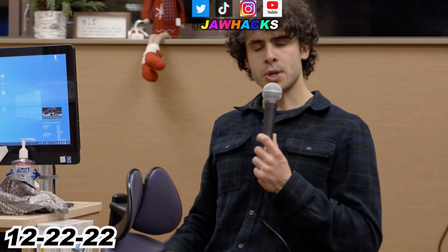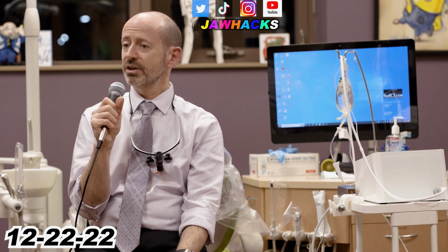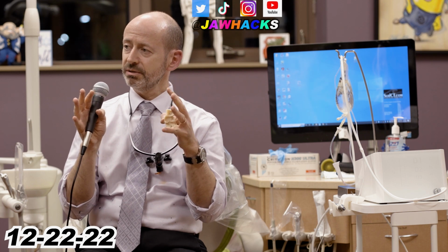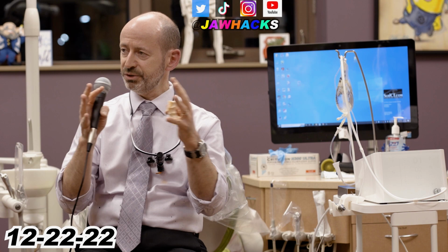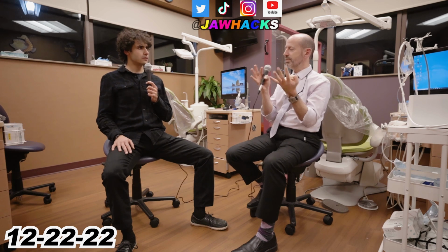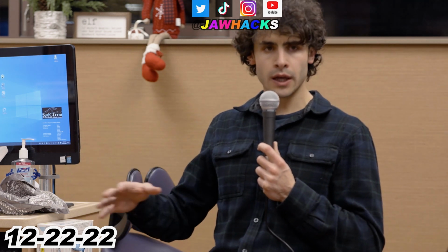So why doesn't turning slower do the same thing? Turning slower, it doesn't start bending the MSE right away. It transfers the pressure to the bone in a gradual manner. It gradually builds up, and then splits. Once you do a lot of turns right away, it just starts to bend right away, and once it starts to bend, it's finished. So there's something about distributing the force over more time that is beneficial to the appliance having success.